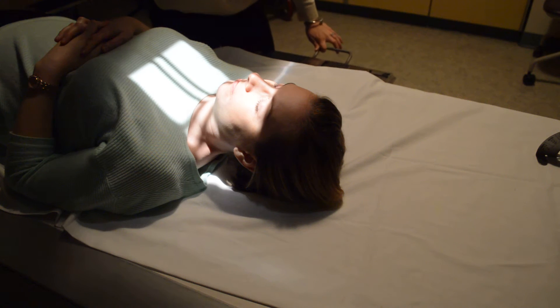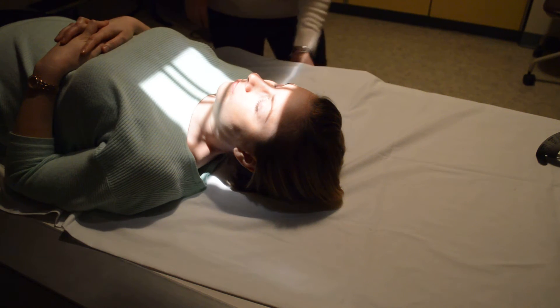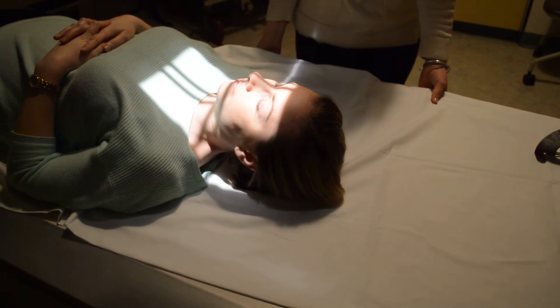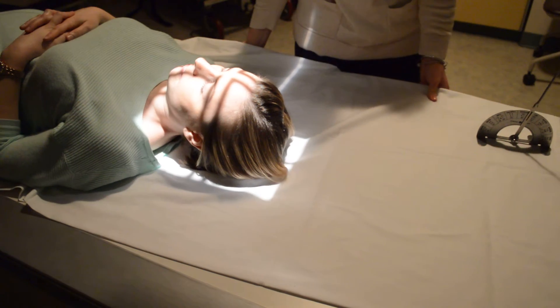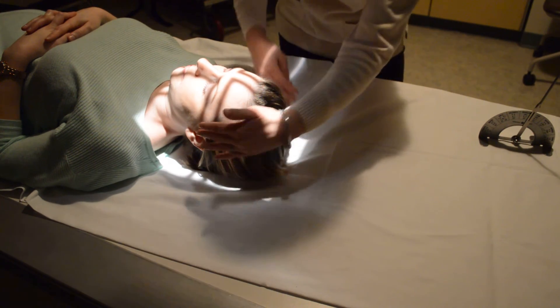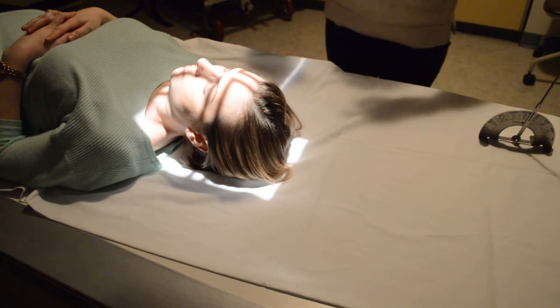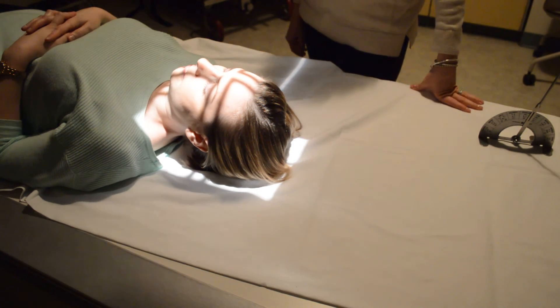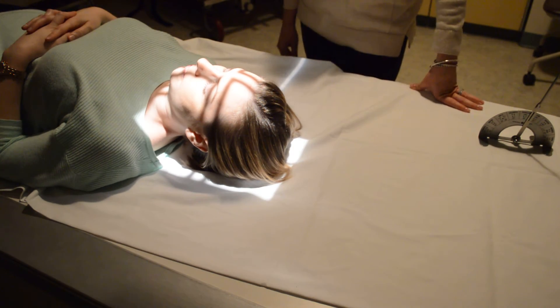I'm going to line up my bucky. The central ray for the PA was at the glabella, so for our AP trauma zero degree it will also be right at the glabella. Make sure you have the top of the head and you're getting the outer margins of the skull. You're not able to manipulate it at all for rotation or tilt. Ask your patient to hold still and click.